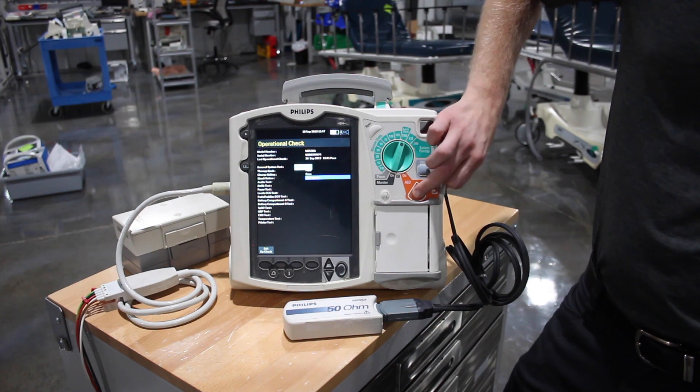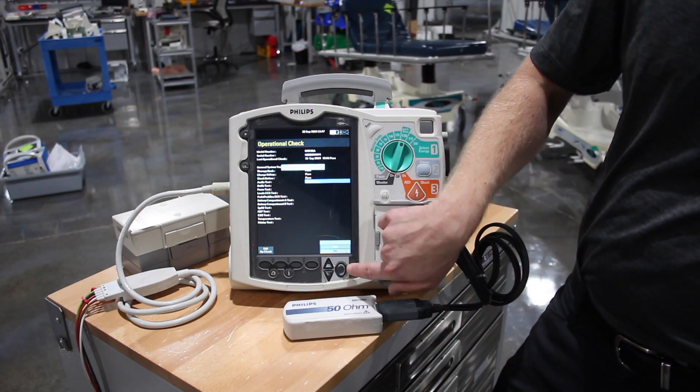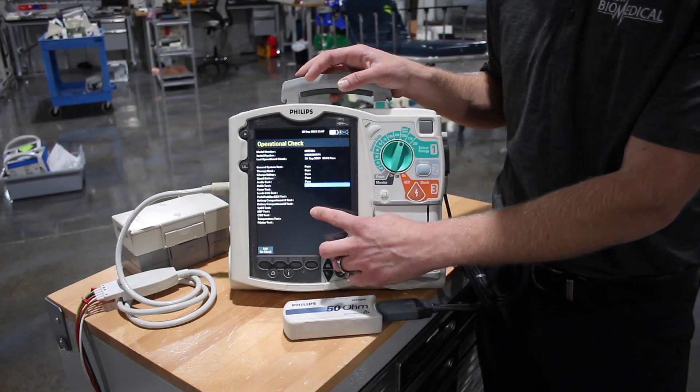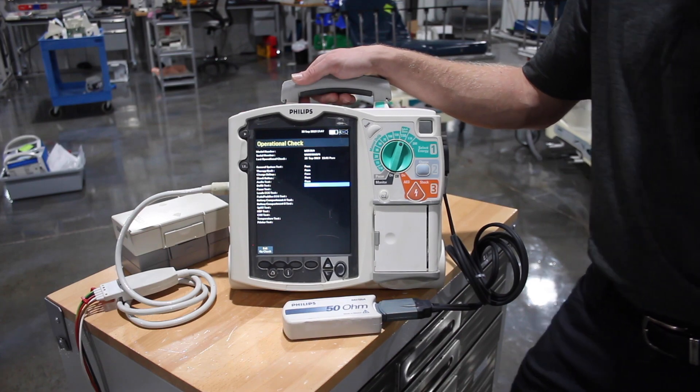It charges up to five joules, shock into the test load, and asks if we heard the shock. We'll say yes, and then it's going to finish testing the rest of your parameters all the way down to your printer and give you a printout of your test.